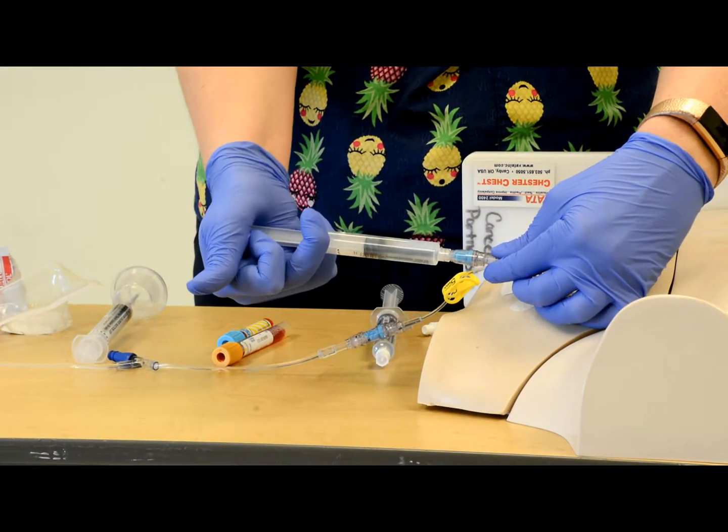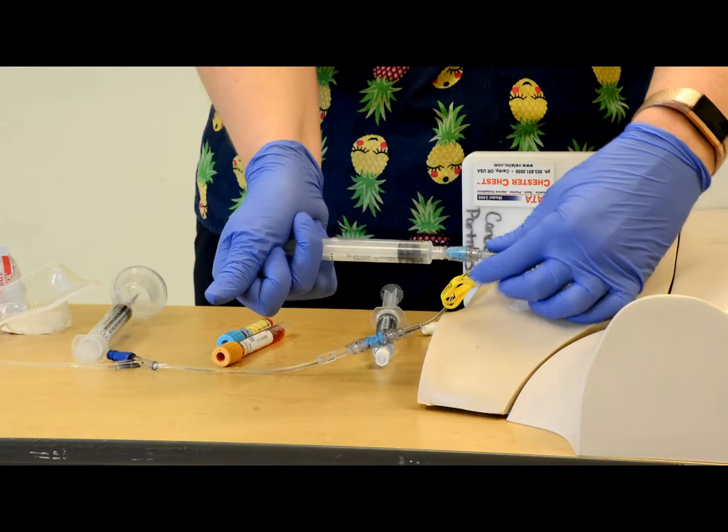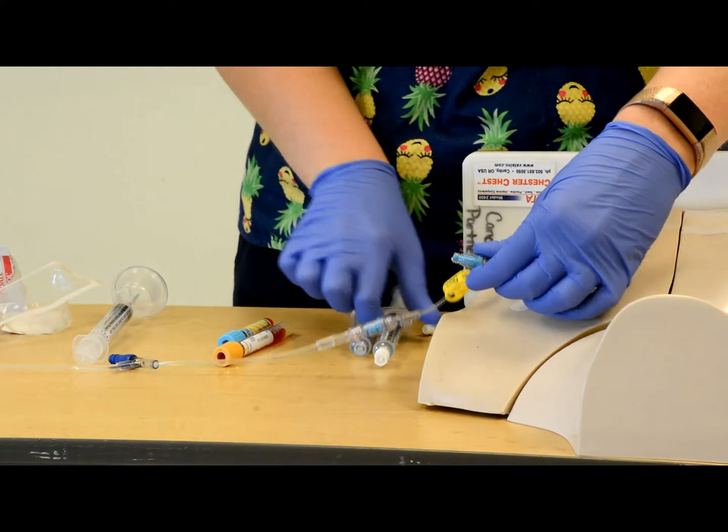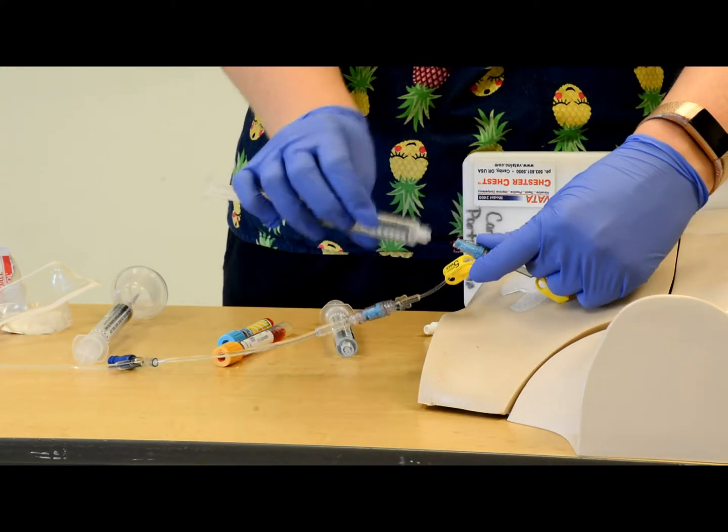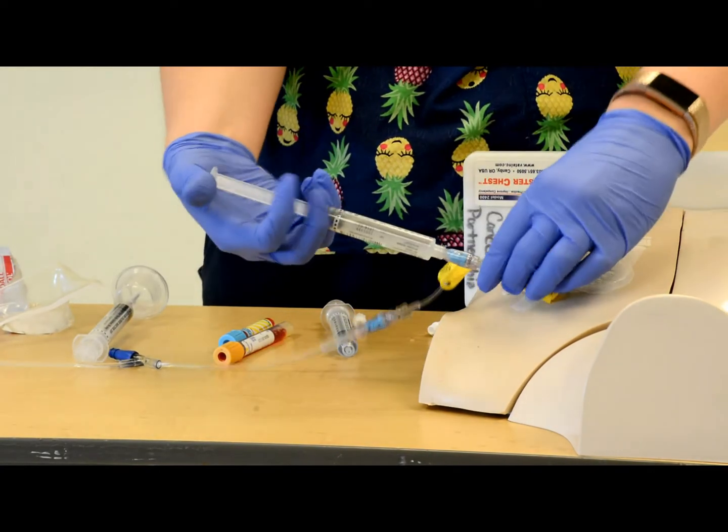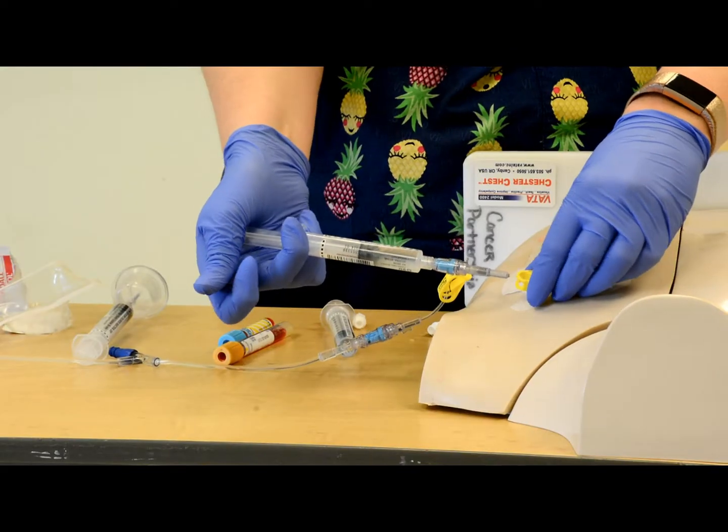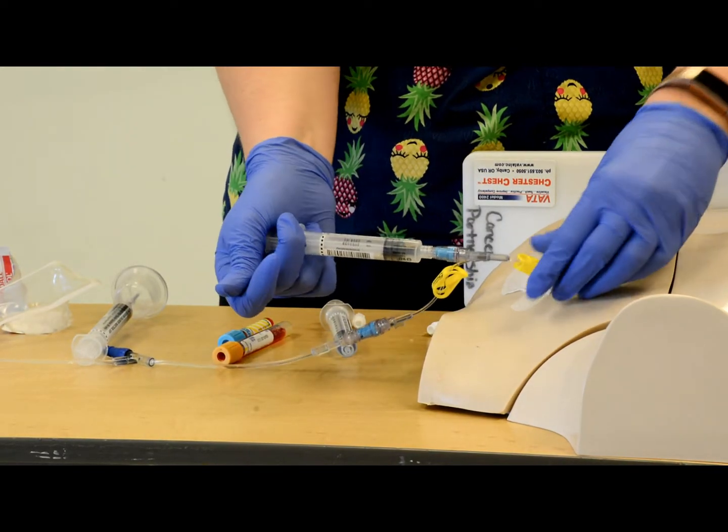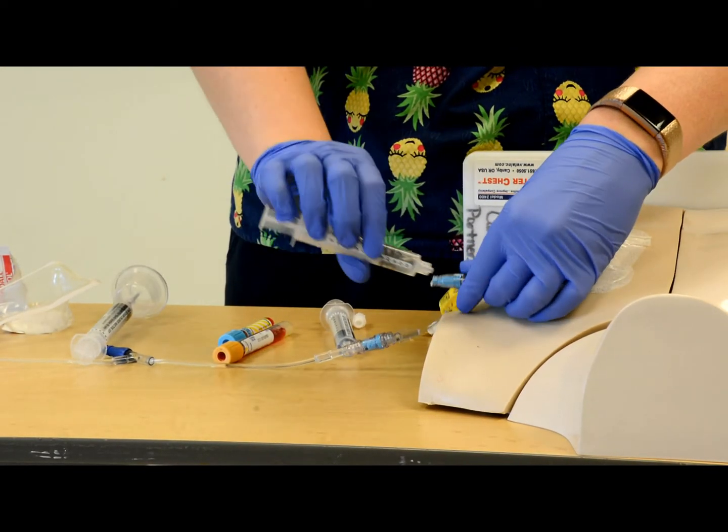When I complete my flush, make sure you use 20 cc's, and when you're flushing the line, definitely use the push-pause method to flush. And make sure that we're clamping in the last few mls, and leaving some in the syringe.